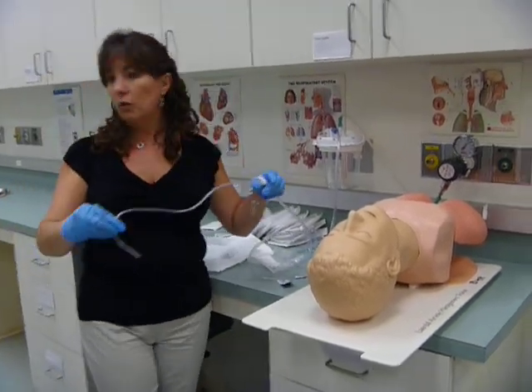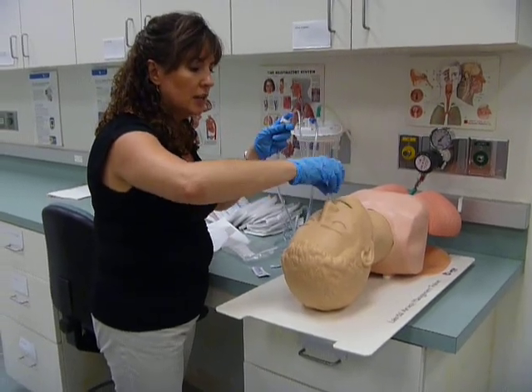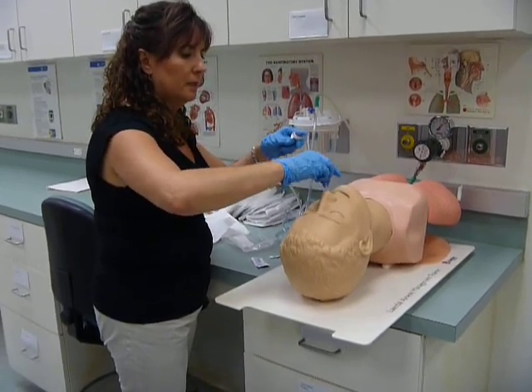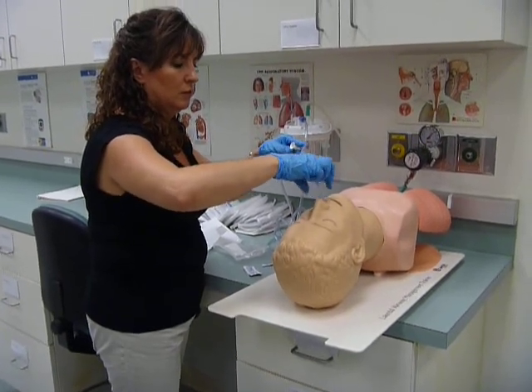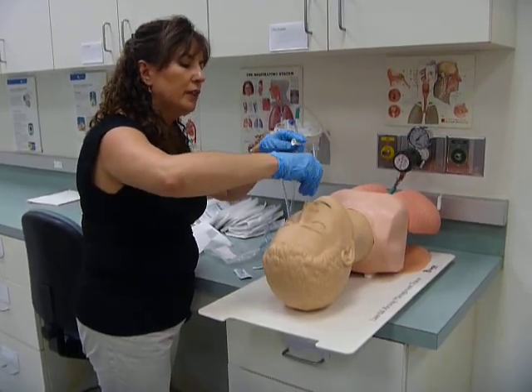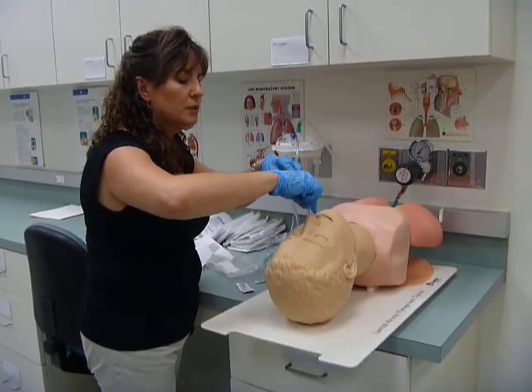Okay, I'm going to go ahead and go again. Again, keeping this hand sterile, touching nothing but the inside of the nare. Slowly advance it down. And like I said, there is a point where you feel like you're going in, and if you don't, sometimes you have to adjust, just try to reposition it.